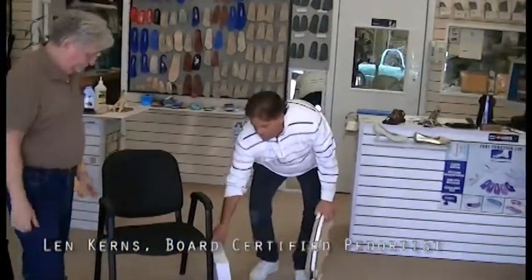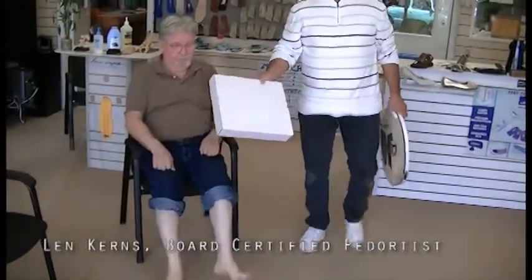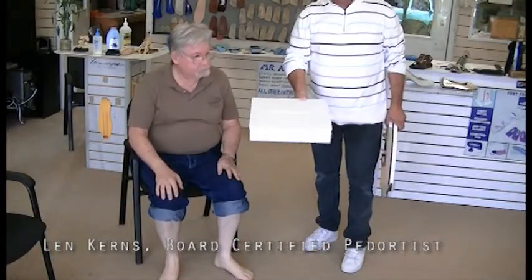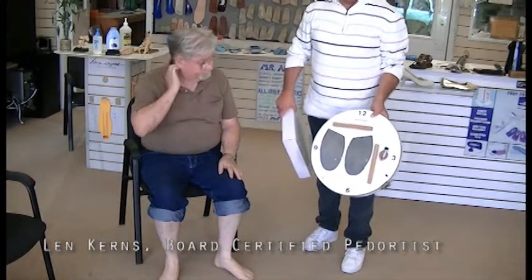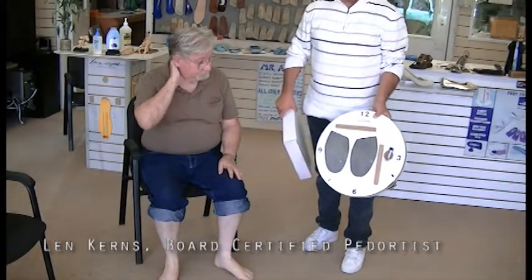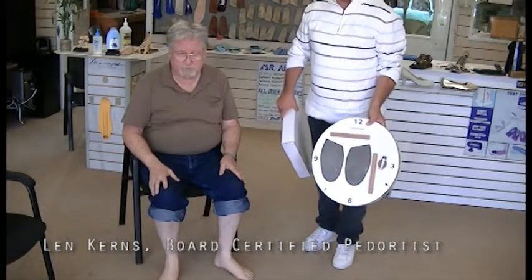Now there are 2 ways to cast the foot. One is straight out of the box, which we're going to demonstrate first. And we put the box on the floor, and we'll move the foot around in a clockwise and counterclockwise position to show pronation and supination. The second way to cast is with a device called a rotator, which takes every bit of effort out of the procedure. It makes it incredibly simple.